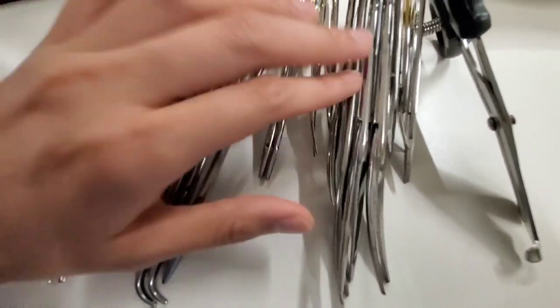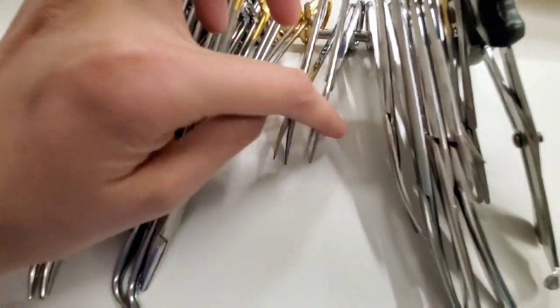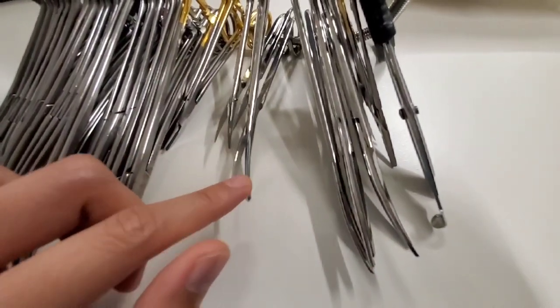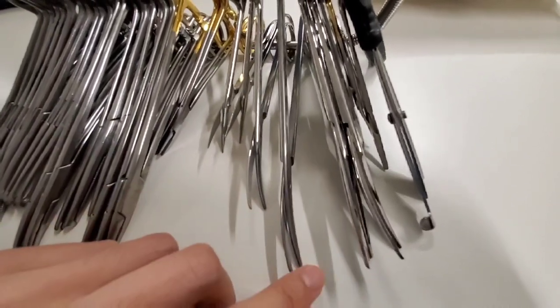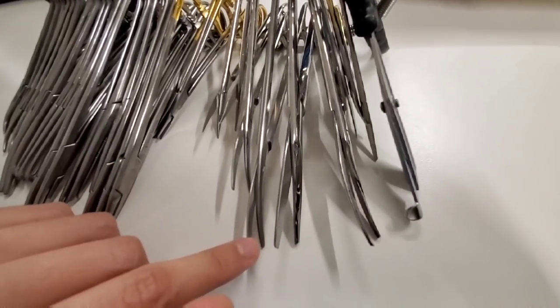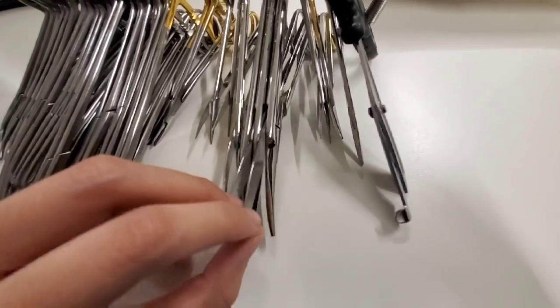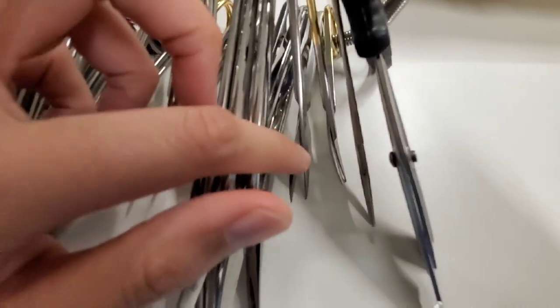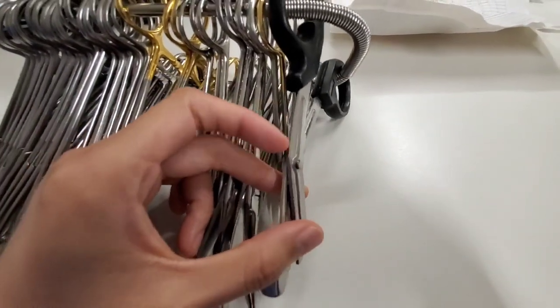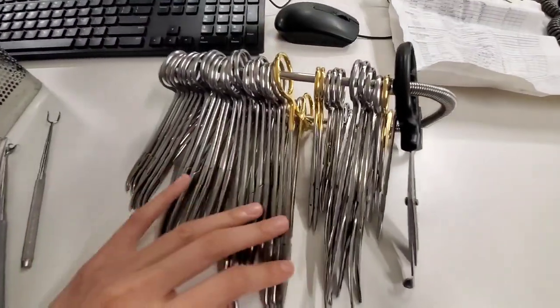Needle drivers of course — every time you go deeper you go longer, more superficial you go shorter. Iris scissors are for more delicate areas. Metzenbaum is for superficial stuff. Straight Mayo scissors are for cutting sutures. Curved Mayo is for cutting fascia or dissection. And this is bandage scissors — you do not use this for anything else but bandage. That is the stringer.